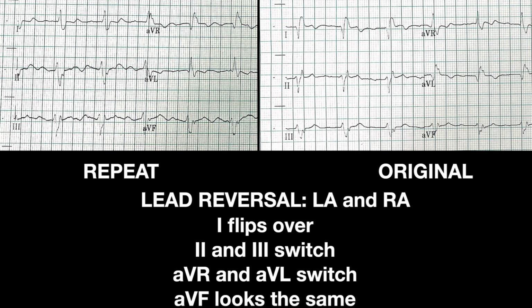Again, that's me walking through it. It makes sense to me, but that's because I sat and thought about it for a little bit. But it's really not that complicated. Is it something you're going to do while the patient's in the ambulance, like, wait, I have to make this determination, see if I screwed that up? No, you're just going to put the leads back on them. You're going to make sure they're in the right spot. And once you're sure they're in the right spot, then you'll go from there.